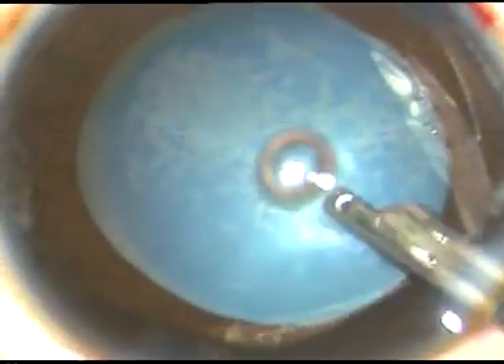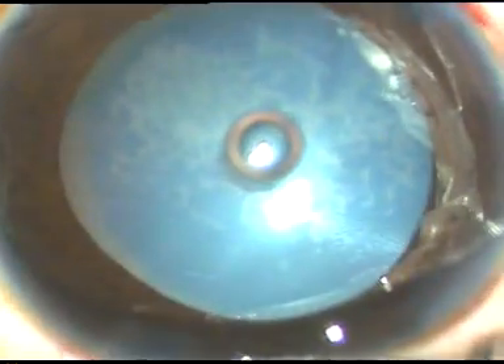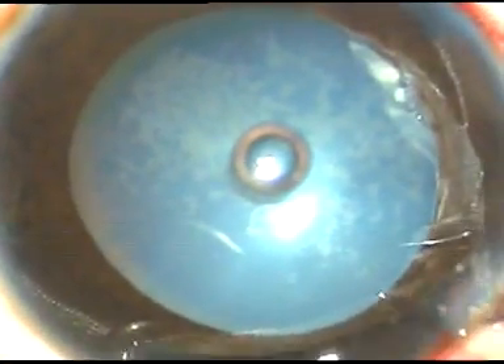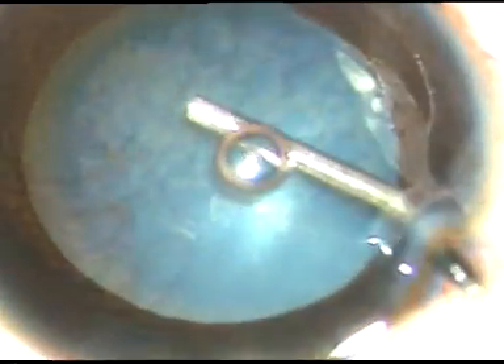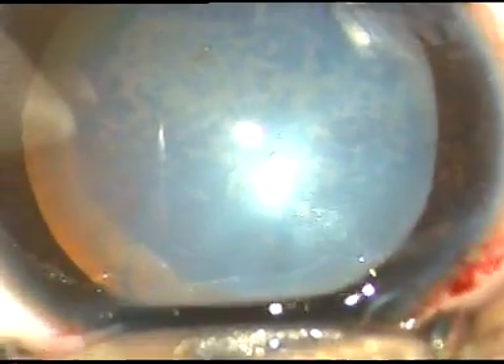You can see the anterior capsule is intact. With the slit lamp we could make out a pear-shaped rupture of the posterior capsule. Now I inject viscoelastic substance, and I am going to do a capsulorhexis of about 5 mm size.